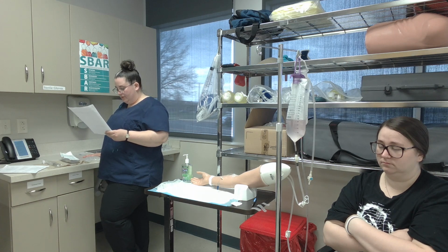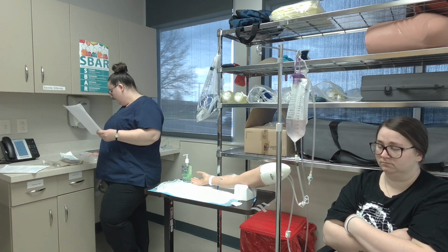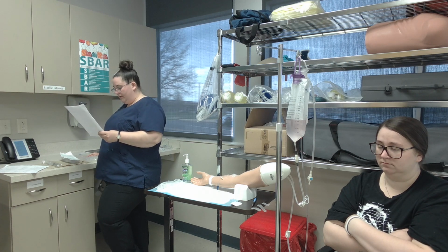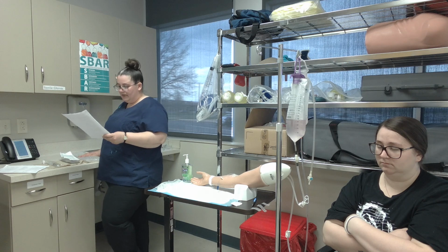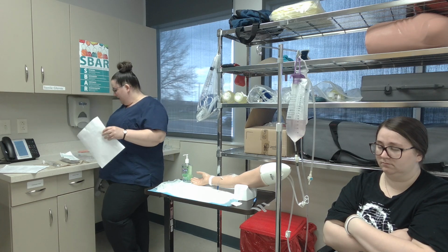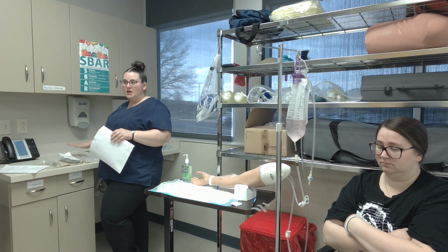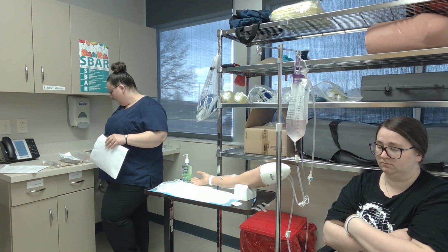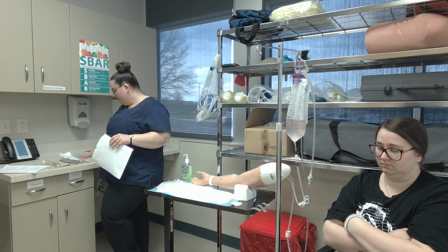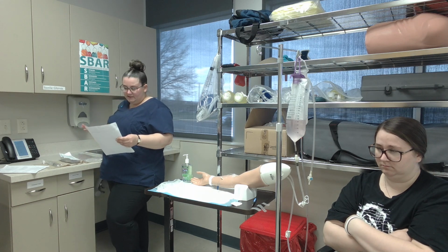0.9% normal saline, 1000 ml IV continuous infusion. Status is active, and this med has not yet been given. It will be given at 10:45 a.m. Packaging would normally be intact. I would make sure that it is new packaging, no rips or tears, and no crystallization or particulate matter in the medication. The expiration date is January 26th. So that medication is okay.